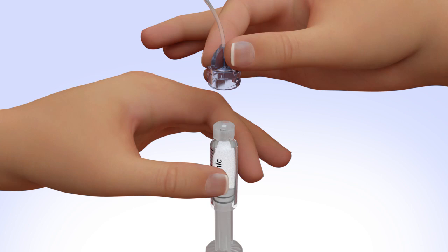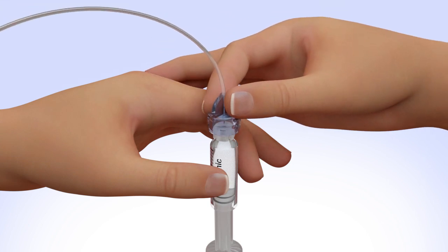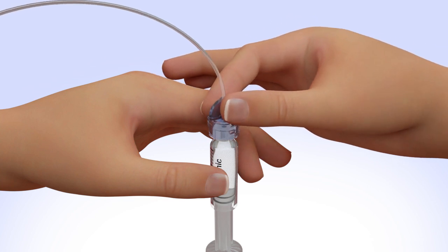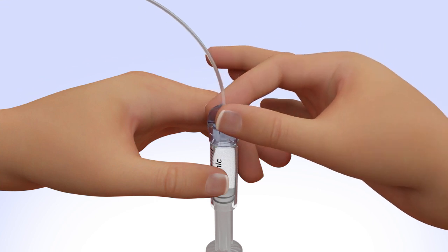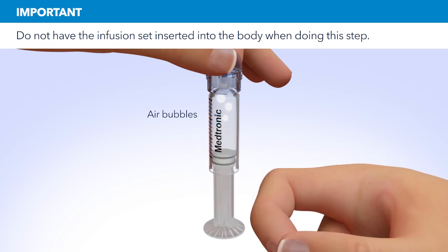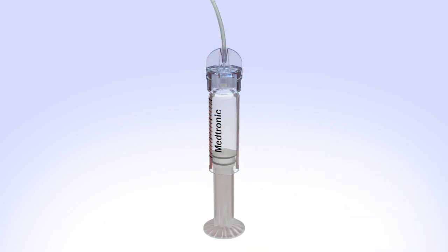Hold the tubing by the connector and place it on the top of the reservoir. Find the right position by turning and gently pushing the tubing connector until you feel it slide smoothly in place. Turn the tubing connector clockwise until the reservoir and tubing connector lock with a click. The tubing connector should not be loose or come apart from the reservoir. Tap the reservoir to make any air bubbles rise to the top.